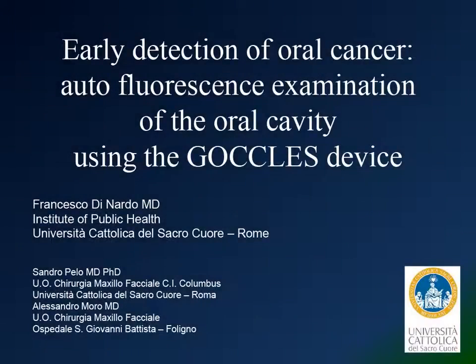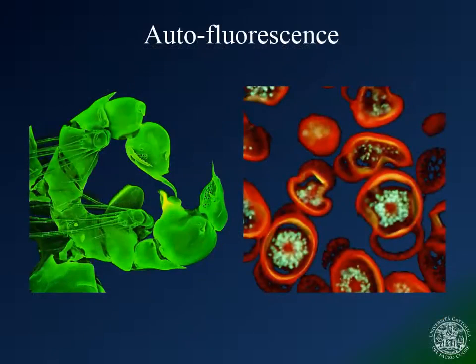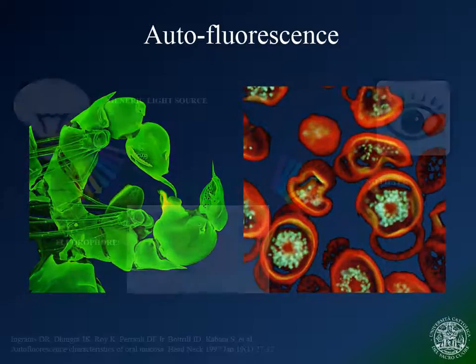Welcome to this brief guide to autofluorescence and autofluorescence examination using the Goccles medical device. Some tissues emit fluorescence when lighted by visible light. This phenomenon is also known as autofluorescence.